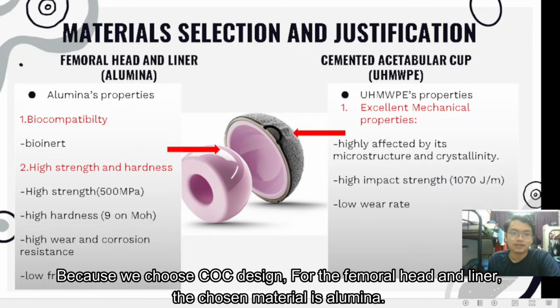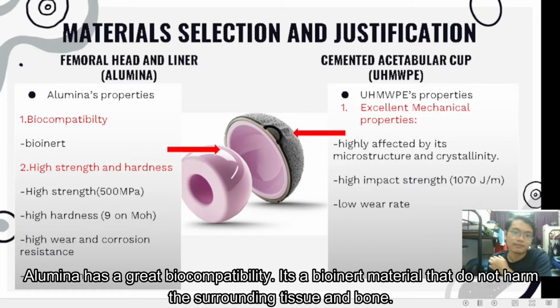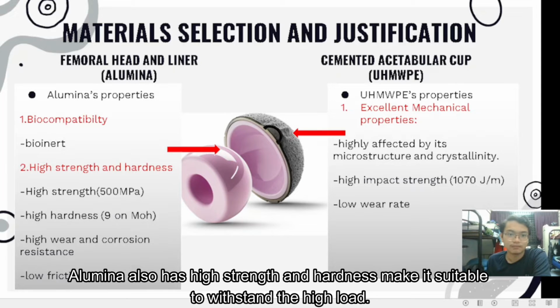It stimulates bone growth by increasing the osteoblast activity under optimized conditions. Because we choose a ceramic-on-ceramic design, for the femoral head and liner, the chosen material is alumina. Alumina has great biocompatibility. It is a bioinert material that does not harm the surrounding tissue and bone.